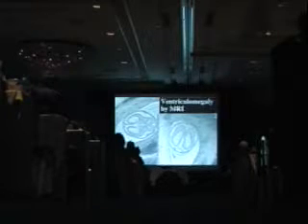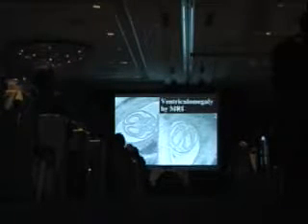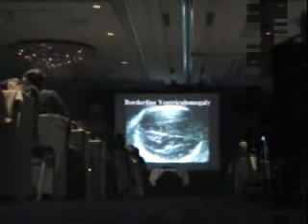Now, one of the few places where I would recommend an MRI is intracranial abnormality, particularly ventriculomegaly. The MRIs can be helpful to detect some of the causes of ventriculomegaly and some of the disturbances in brain formation which escape the detection by ultrasound.